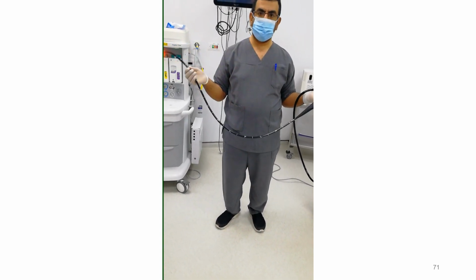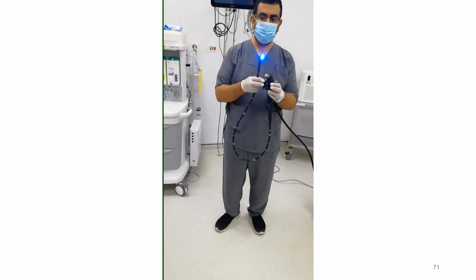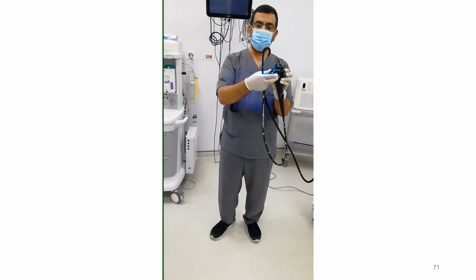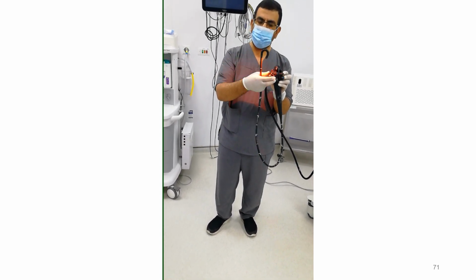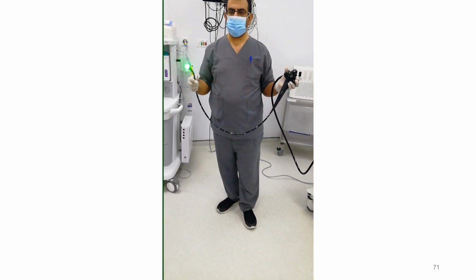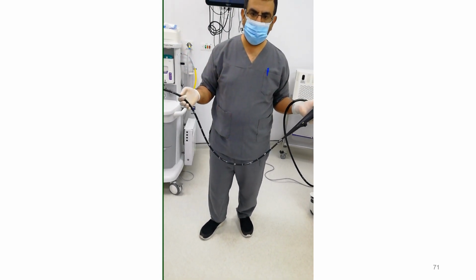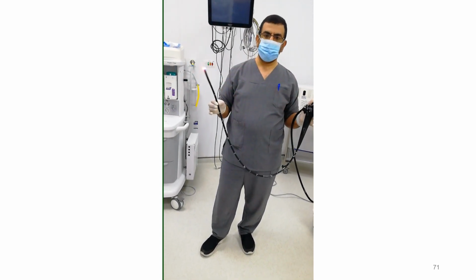طيب أنا أزود الريفليكشن إزاي؟ بسهولة جدا خاصة لما بتستخدمه في الريكتم. دايما المنظار قديم أو جديد أعمل ريفليكشن بطريقة سهلة قوي، ماكسيمم آب وماكسيمم رايت. شوف هيحصل معايا إيه؟ الزاوية زادت جامد قوي. يبقى الماكسيمم آب والماكسيمم رايت بيزودوا لك درجة الريفليكشن، فبيسهل لك حقن الفندس أو إنك تعمل ريفليكشن في السيكم علشان تدخل الأيليوسيكال فالف أو في الريكتم علشان تشوف الحاجات اللي تحت للعين. يبقى دي الأنواع الرئيسية عندنا للحركة.